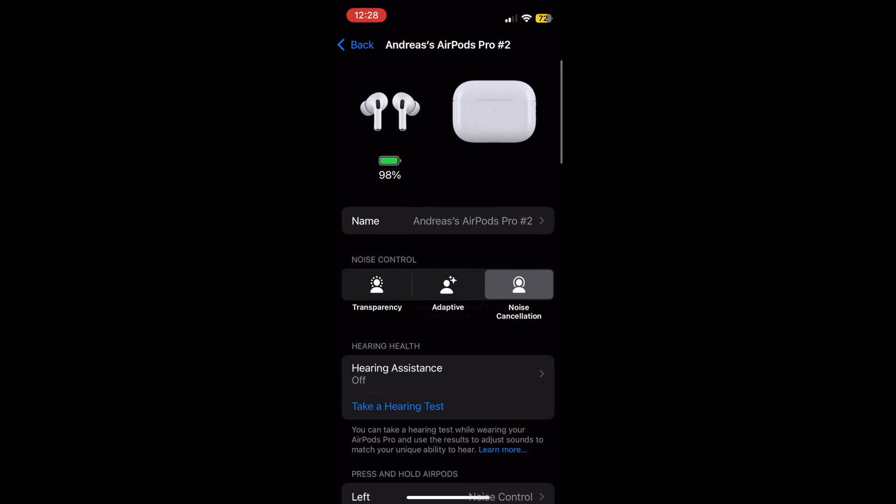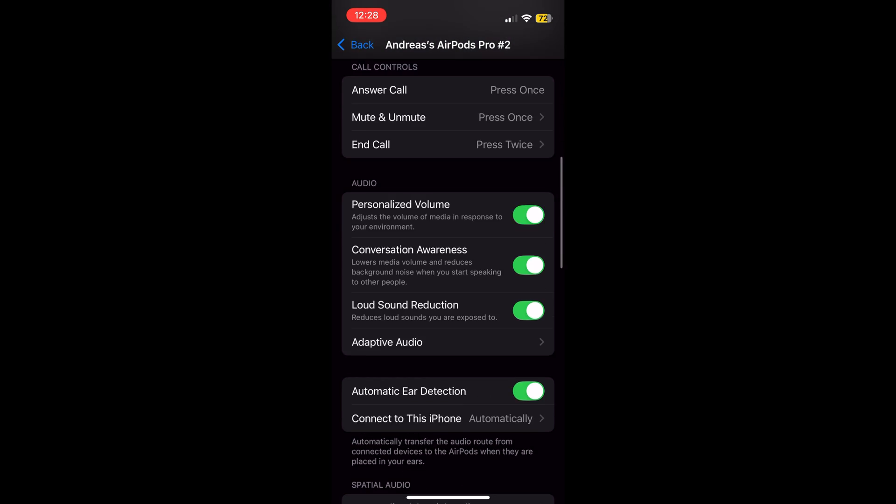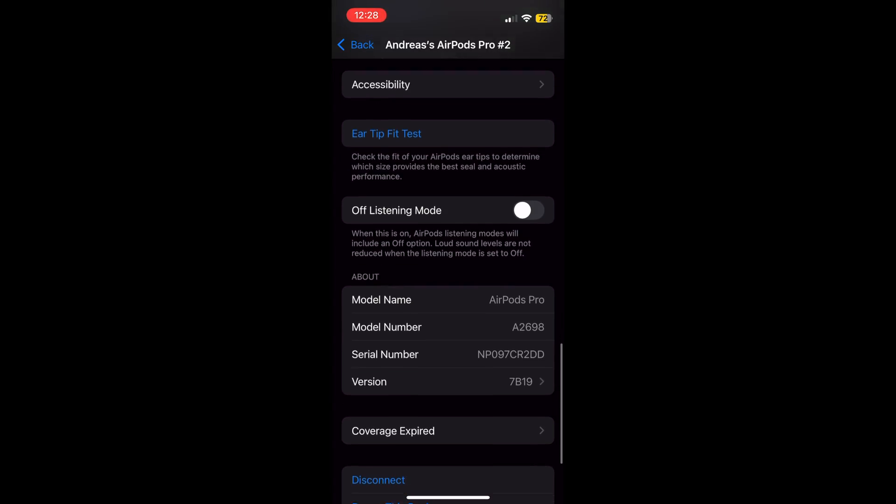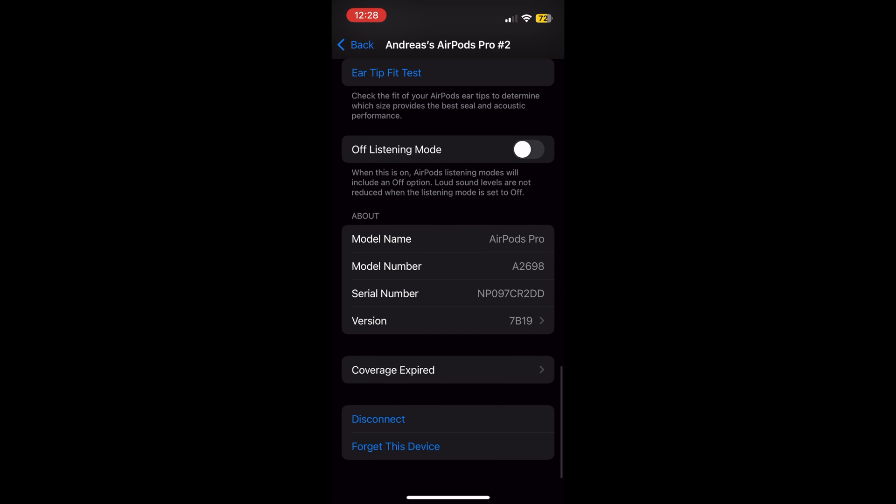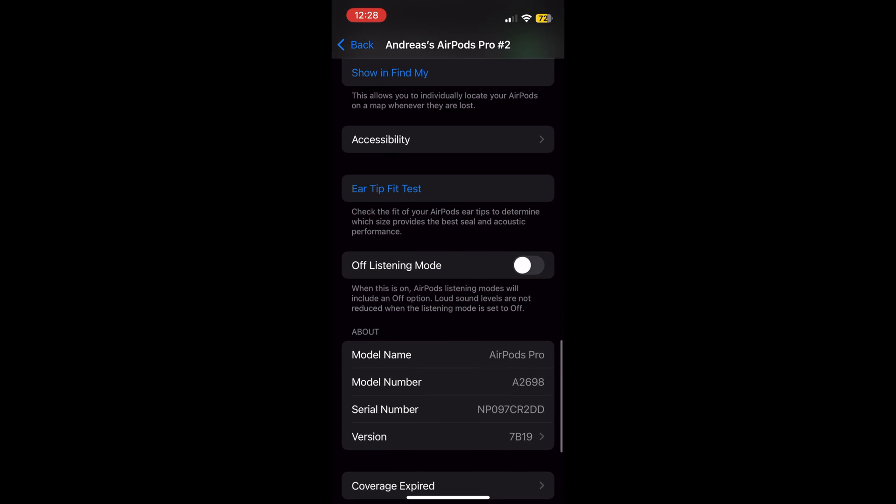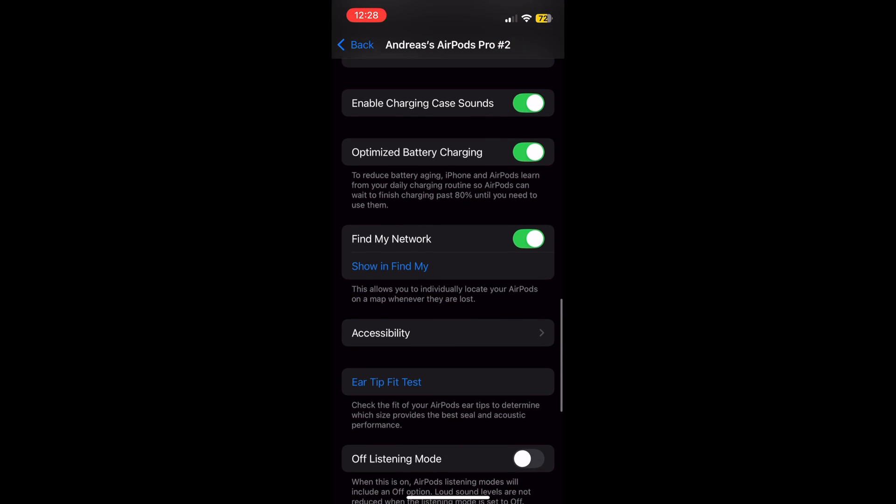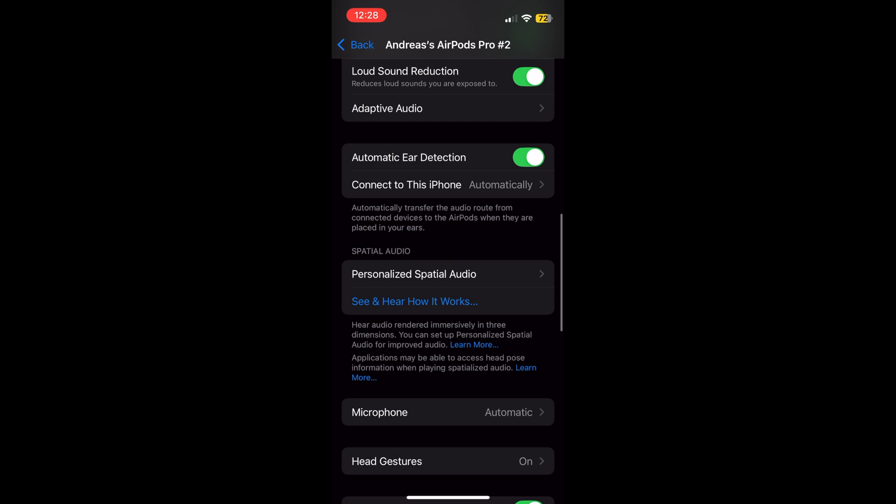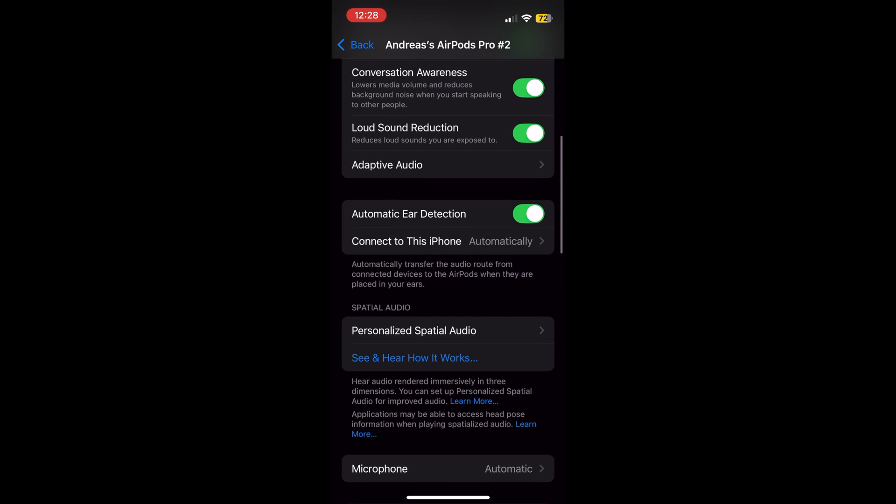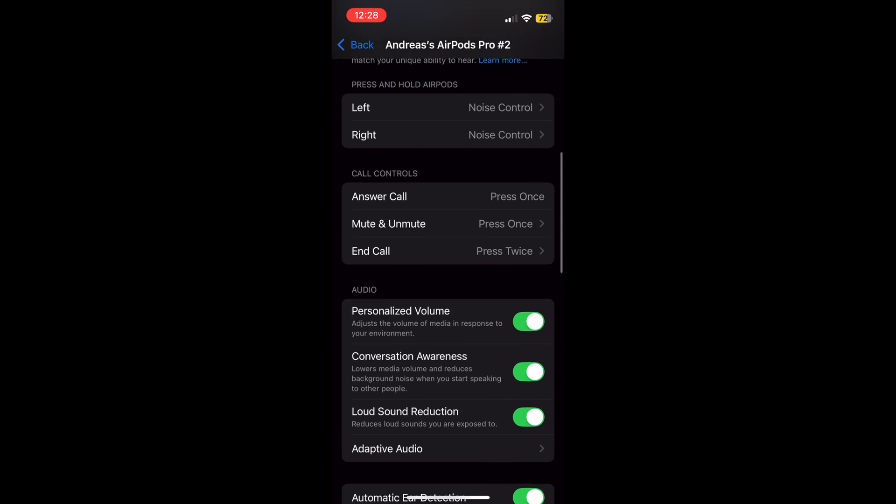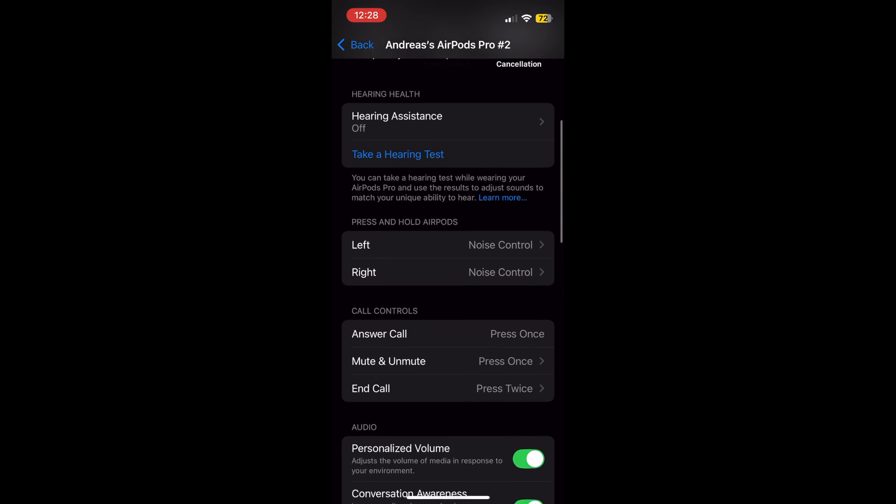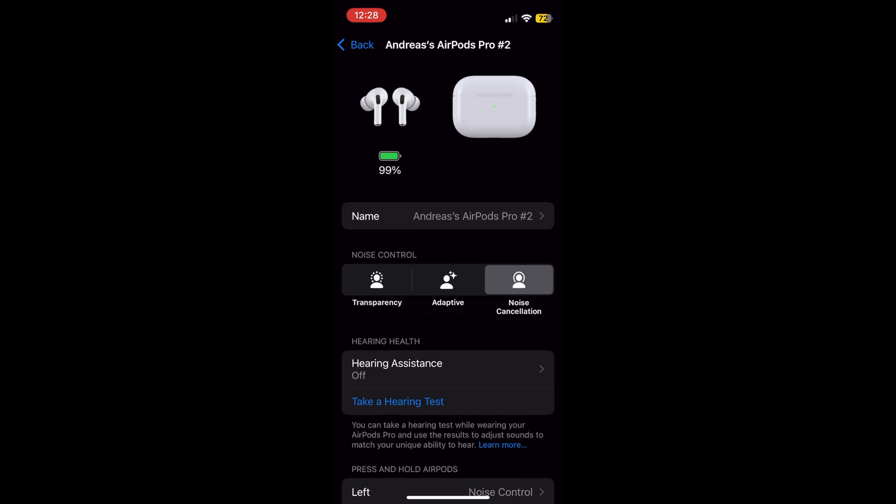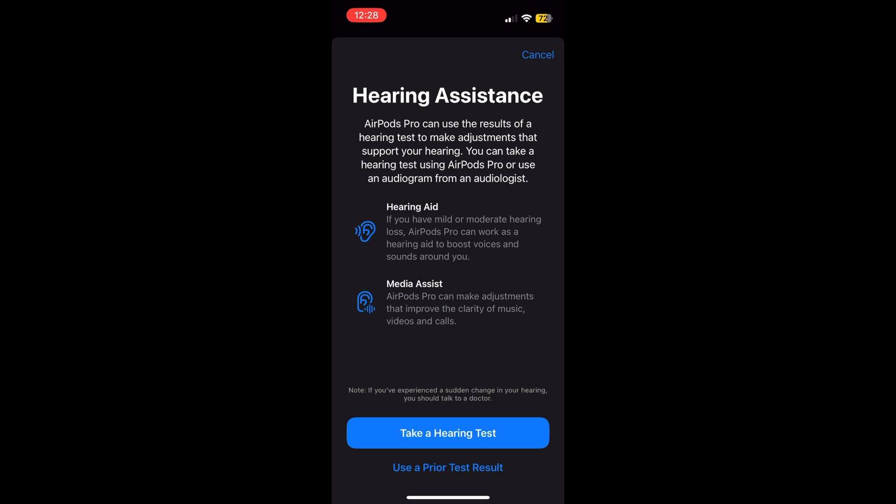AirPods Pro 2 enhance user accessibility for mild to moderate hearing needs. To do this, simply go to Settings and tap on AirPods Pro 2 to get access to the hearing test.